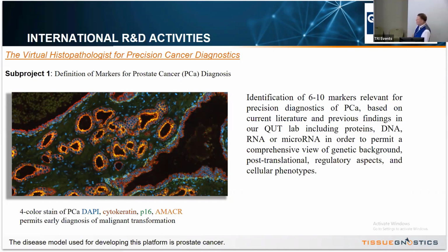With multispectral imaging, we can do maybe 8 to 10 markers simultaneously. If we need to do more, we have to do multiplexing. The challenge of multiplexing is that in each staining round, you have to use the same set of fluorochromes, but linked with other markers. So you need to make sure that in rounds 2 and 3, there's nothing remaining from the signal in round 1 or from the previous round.